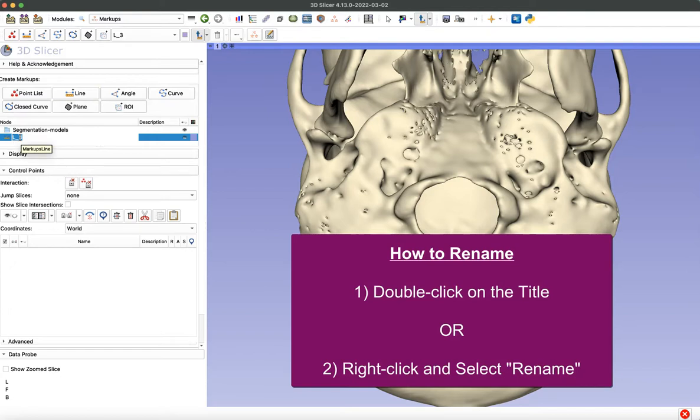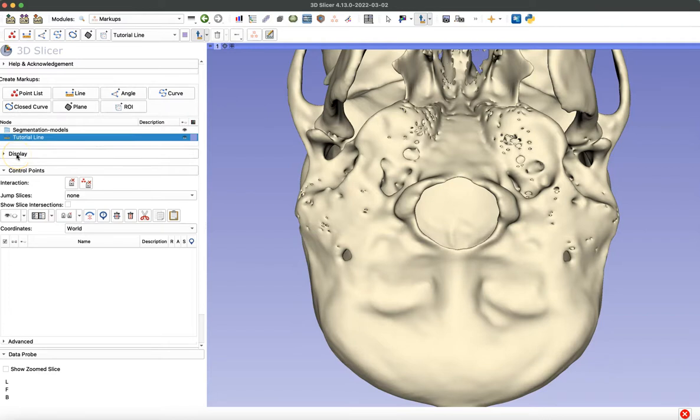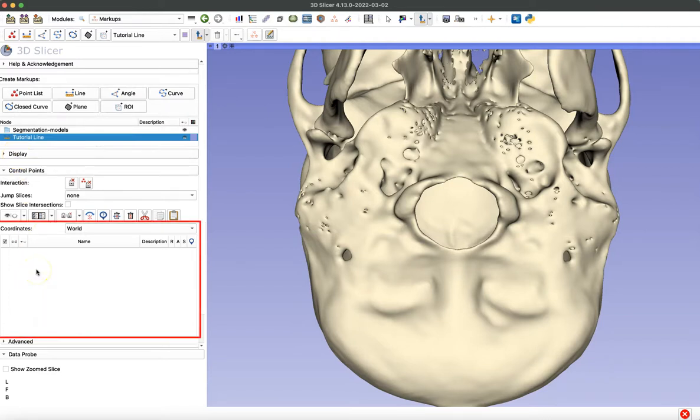I'll just rename it by double clicking and call this tutorial line. So now you'll place your two coordinate points that are going to make up your line, which are going to show up in this space below.